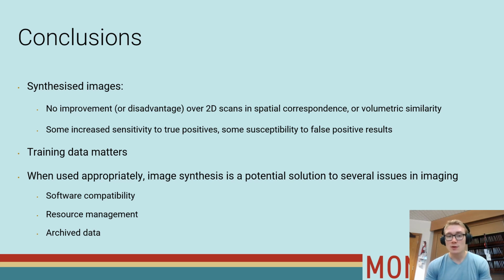But overall, synthesized images in quantitative neuroimaging should be approached with caution. But if used sensibly, they can be used to coerce 2D images into software-compatible 3D images, reduce the resource burden of pilot studies, and allow for the quantitative analysis of retrospective clinical data, which would otherwise be ignored.